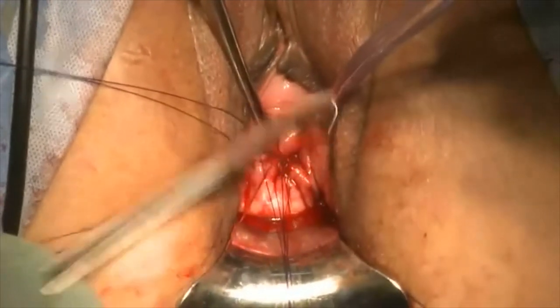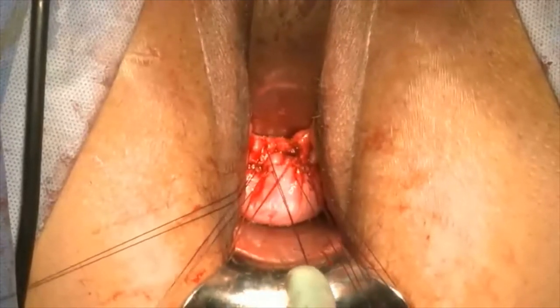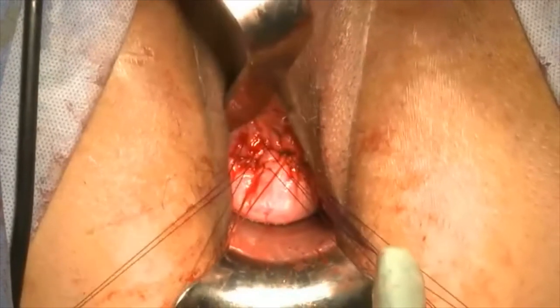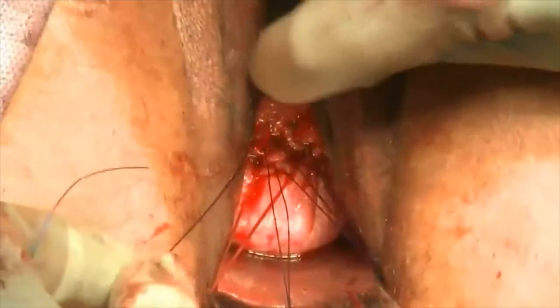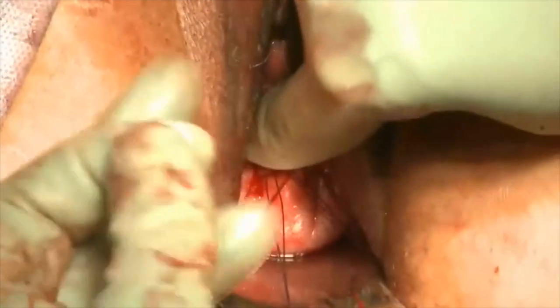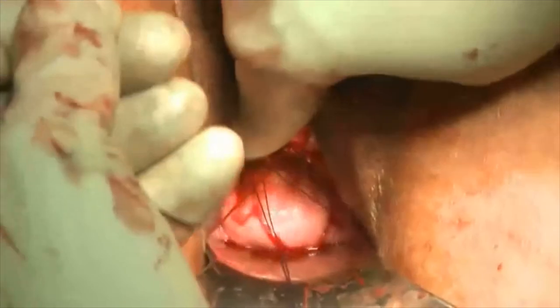We start tying the sutures and suspending the cuff, which will nicely go up towards the sacrum, one suture at a time. We tie all six sutures, and we're demonstrating here how adequately the vaginal cuff is suspended.